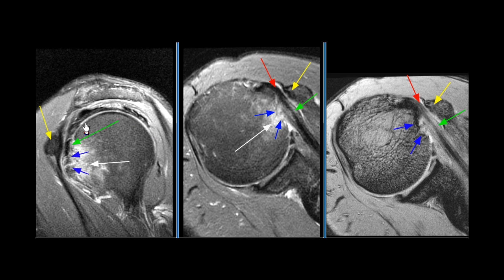There is rotator cuff tendinosis with mild bursal surface fraying of the supraspinatus tendon. These findings are consistent with subcoracoid impingement and rotator cuff tendinosis.